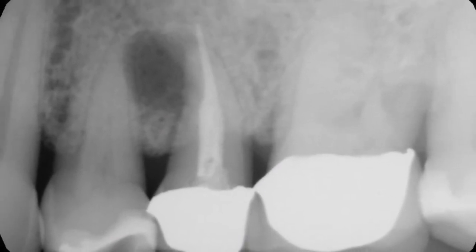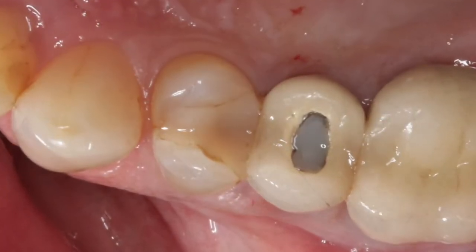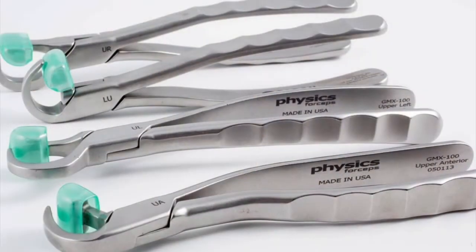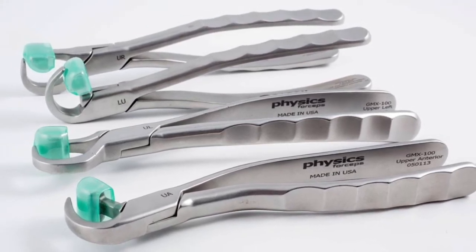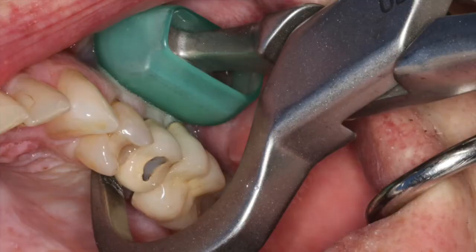You can see we had root canal treatment and significant bone loss around this tooth. So what we're going to do is use the Golden Physics forcep, which is a technique that we use to remove the tooth without putting a lot of tension. The instrument consists of two components: a beak and a bumper.